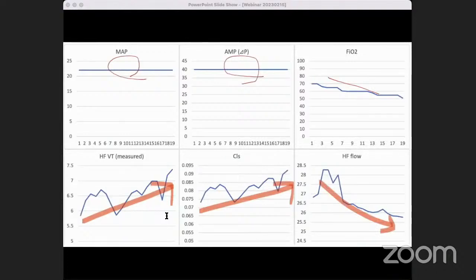The relationship between the pressure supplied by the ventilator, lung compliance, and the tidal volume varies based on the lung dynamics. This relation is the same in HFO. The change in compliance and tidal volume as respiratory status improves is a very important change to monitor.